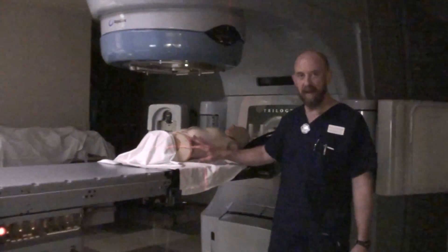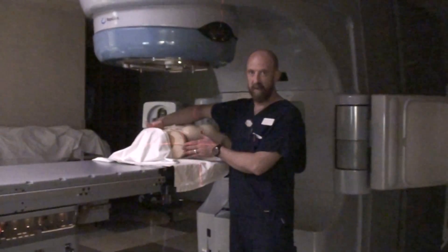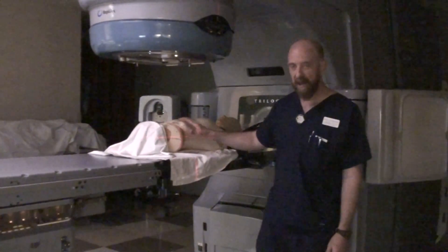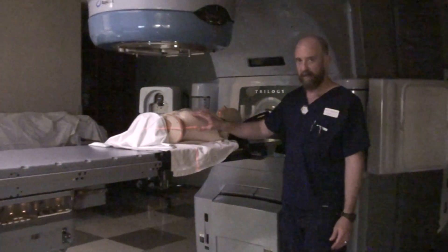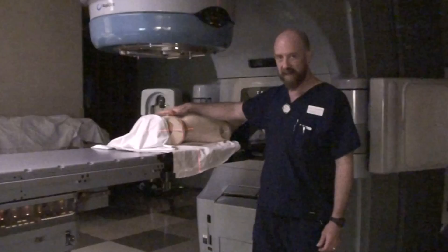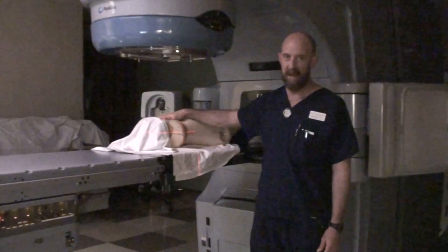Pelvis treatment — once again it's a three-point setup. You're going to have marks on both hips and an anterior mark. In this particular case we are below the inferior costal margin, so all of this soft tissue on the anterior is suspect — it doesn't tend to want to be in the same place day in and day out.